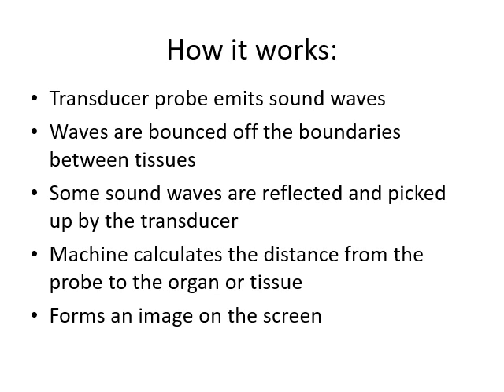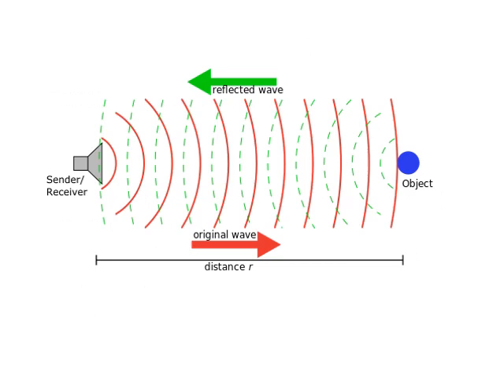All right, so we've got sound waves, we're going to be measuring distance, and then we will be converting that into a picture. A lot of times the colors of an ultrasound are black, white, and grays. But we'll have a little exception to that at the end. So basically, this is the diagram you should have.